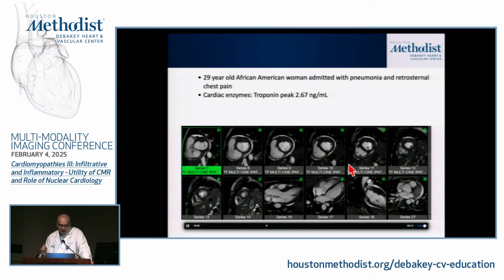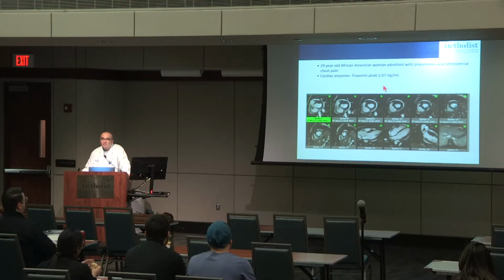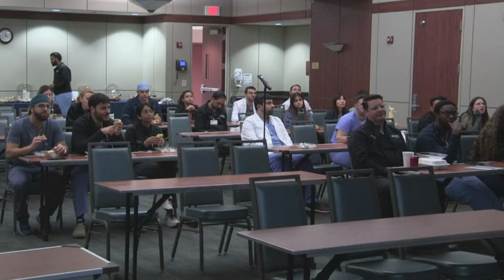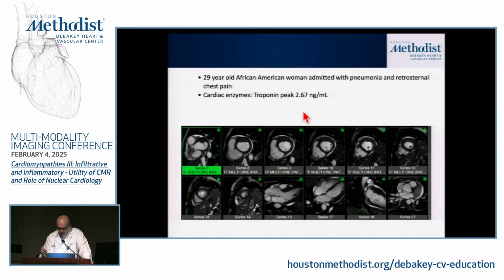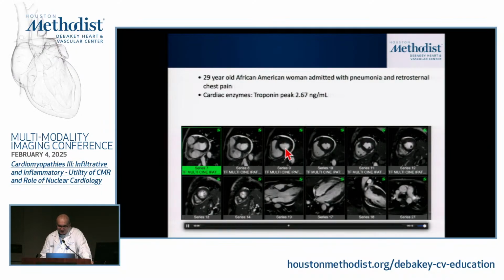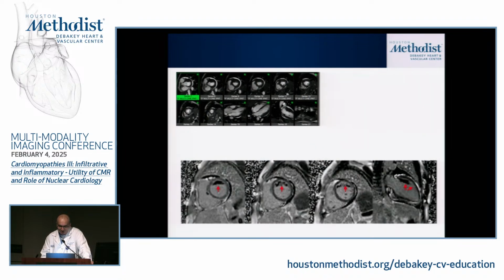Okay. So looking at this, can anybody give me a diagnosis? Or not really, right? You say more information, right? You can always ask for more. So the one always right answer in MRI is if you can say, show me the contrast MRI, right? Because that's going to show you the tissue composition. The cine imaging just shows you the morphology and function, but let me show you now the contrast. Okay. Now what do you guys think?